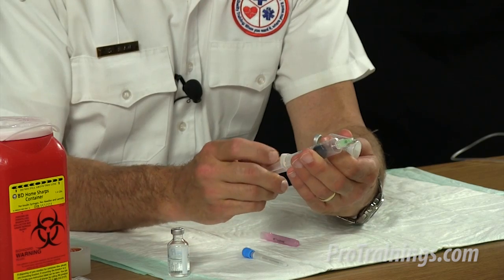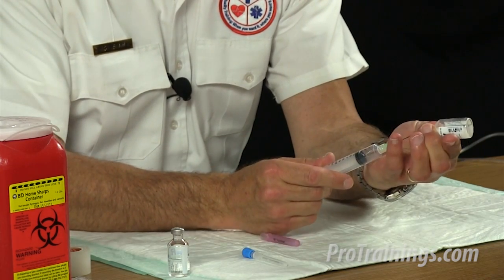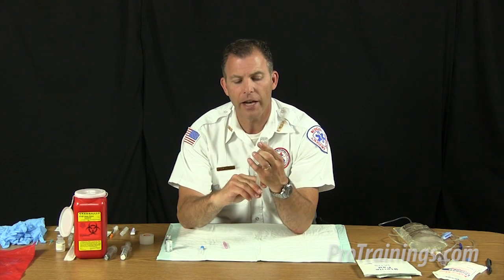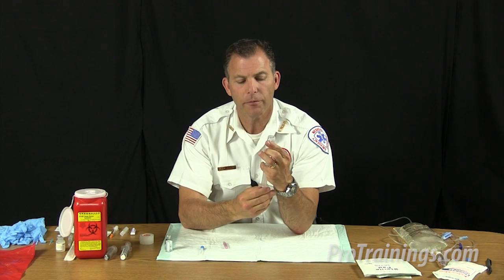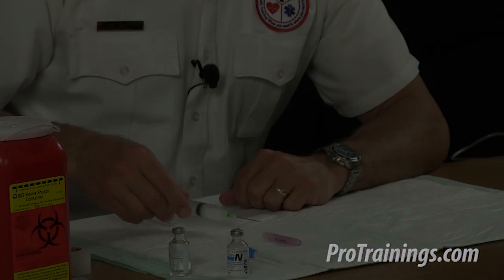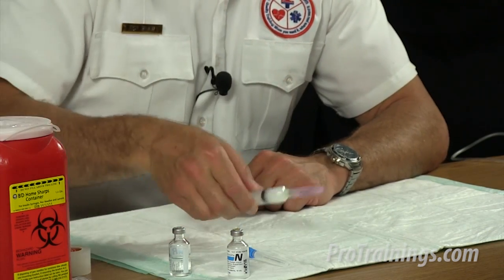the medication. If I'm going to be drawing up, let's say, 4 cc's of medication, I'm actually going to insert that amount of air into the vial. This gives me enough pressure to be able to actually withdraw the appropriate amount of medication. Remember to use the one-hand recapping technique.